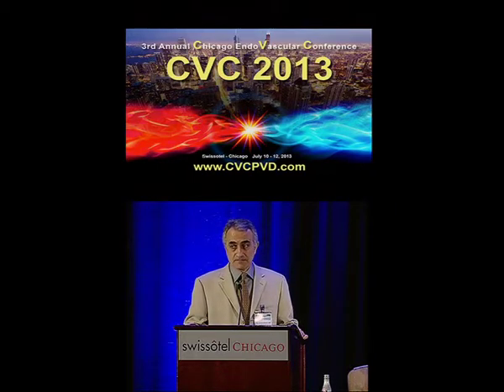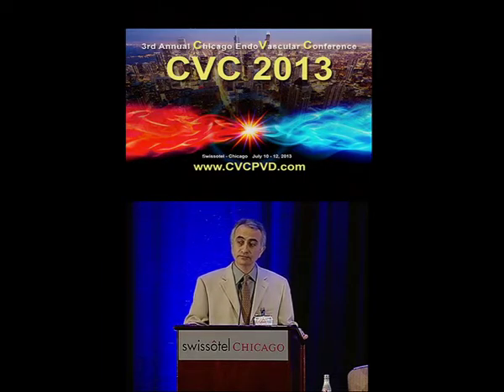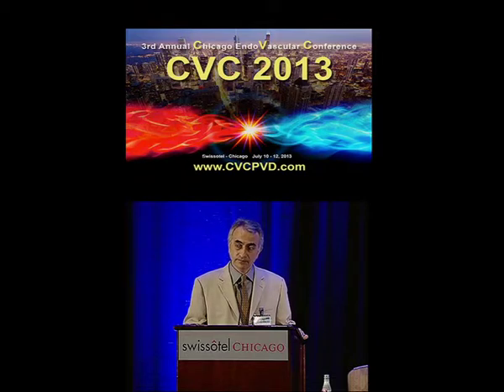And just as a comment, I've been so disappointed with central vein stenting for dialysis patients that I've changed my algorithm to do precision banding, the Miller procedure, where you take a balloon to the juxta-anastomotic segment near your anastomosis, make a little cut down, and tie a suture on as your balloon's inflated. That has worked incredibly well for swelling. So if your major problem is arm swelling and you reduce the flow with precision banding, it reduces arm swelling. Now obviously there's recirculation and bleeding time, other issues to deal with.